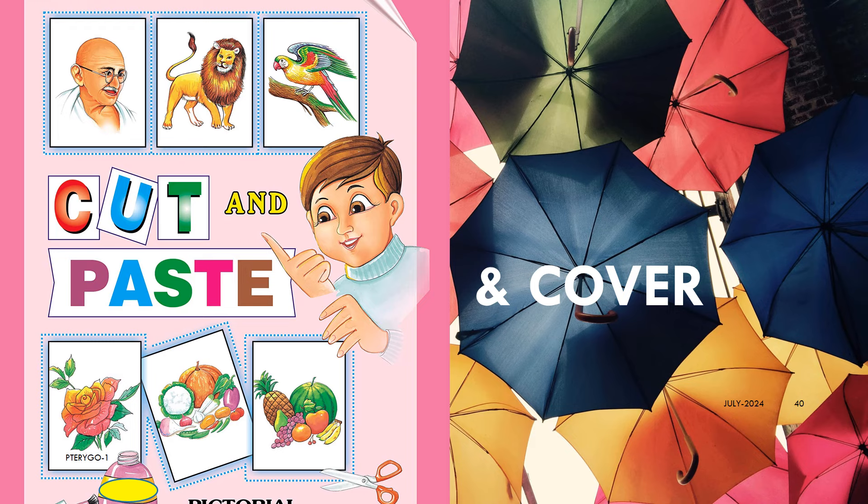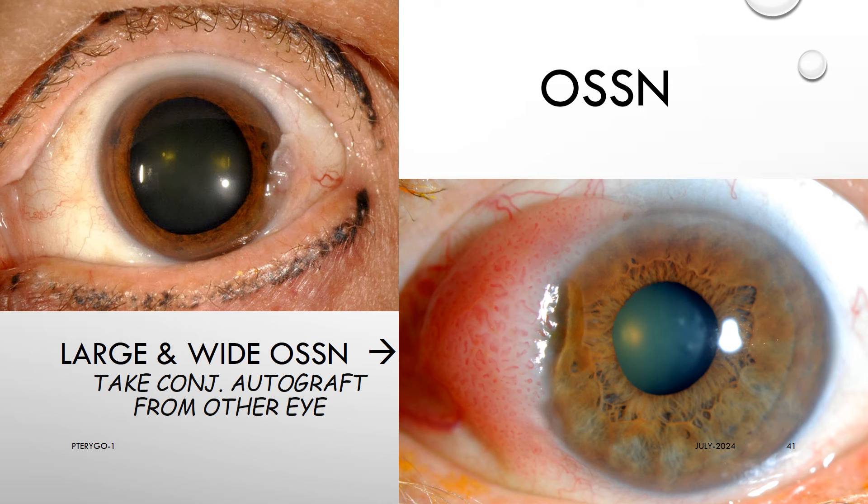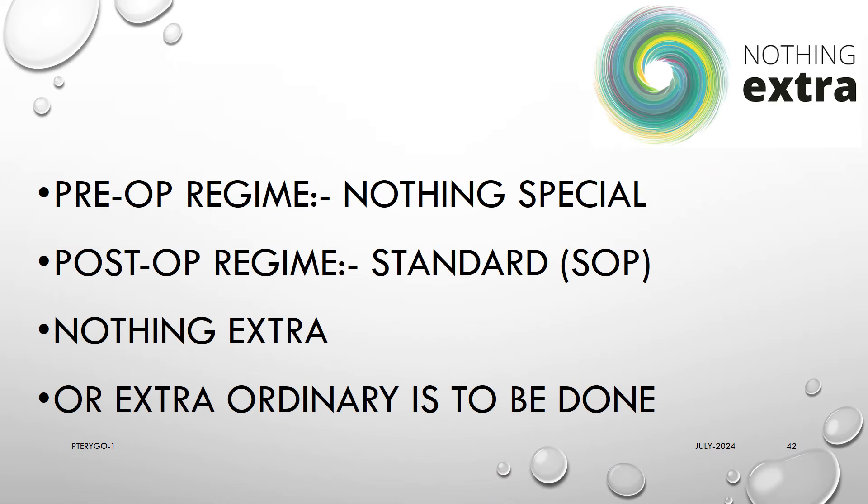We fondly call this the cut, paste, and cover — or cut, paste, and shield — surgery for pterygium. Even for OSSN, we use the same method and same Pterygo lens. If OSSN is too big and too wide, we use a limbal autograft from the other eye of the patient.